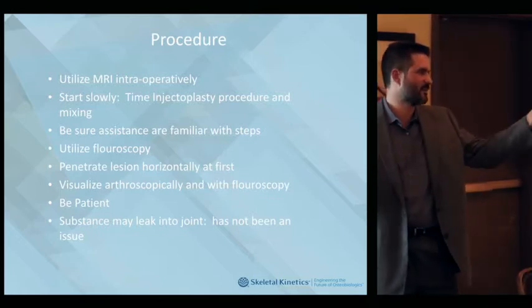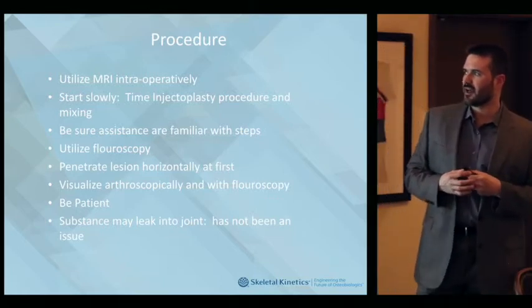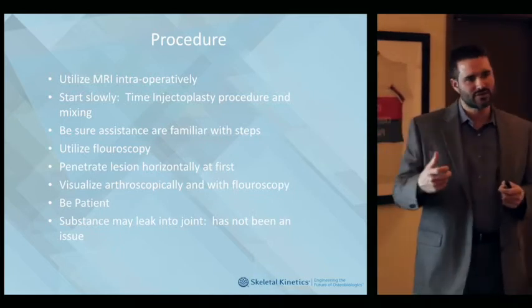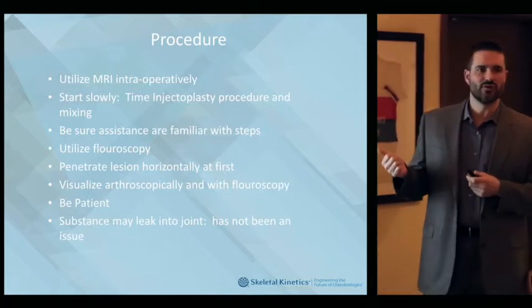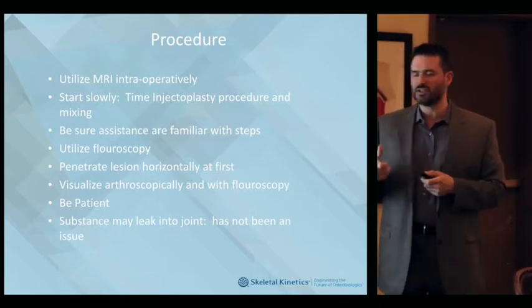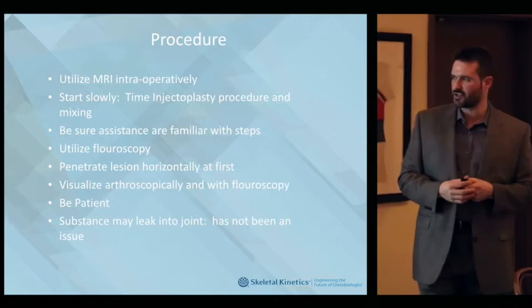I mean, it's even getting simpler now, right, Mark? Yeah. So it's not rocket science, but just make sure your timing, because it's getting hard. You don't want to be injecting. It's already hard, and you're not going to be able to do it. So make sure your assistant's familiar with the steps. Make sure you're utilizing fluoroscopy. Like I said, I would penetrate the lesion horizontally at first, and then over time you can change your direction.